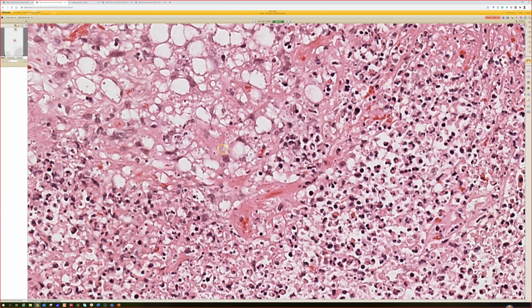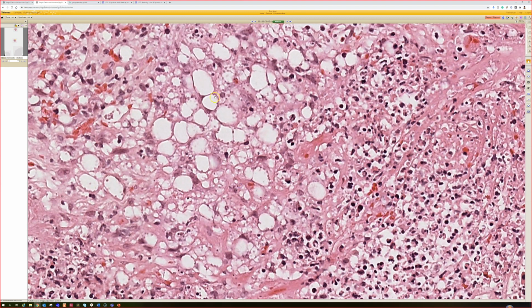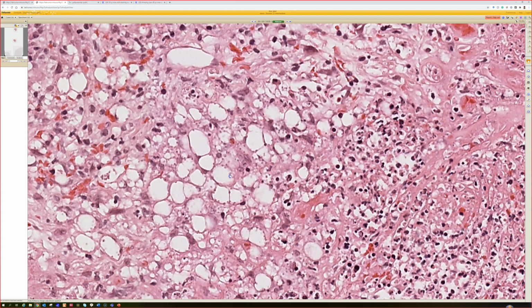I have seen histo that did this though, okay? Maybe not quite this good, but the point is I don't personally feel like that alone is a reliable way to tell them apart with certainty. The other thing is that you're supposed to see a kinetoplast. Now, there ain't no way you're seeing a kinetoplast on this scanned slide, but even in the best circumstance, I cannot definitively see a kinetoplast on a 40x view on my microscope. I'm admitting it right now.